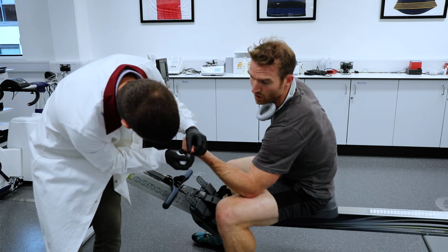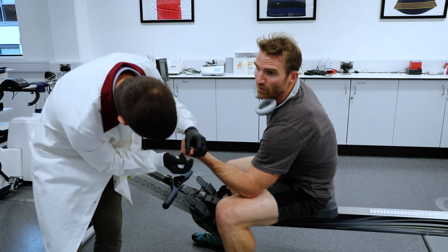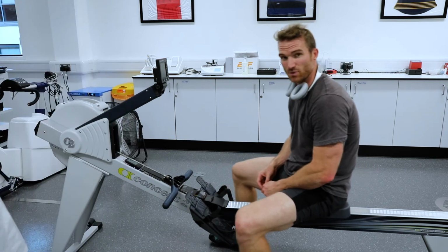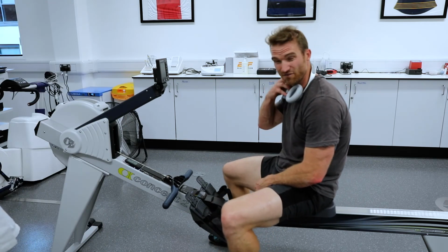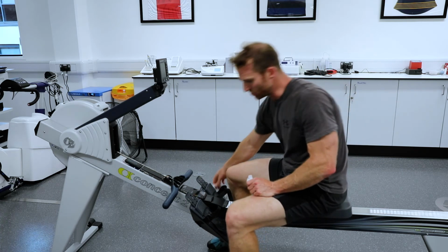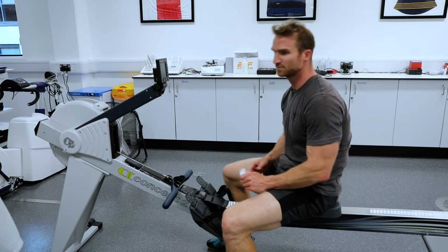So again, it's just to show when the glucose is moving rapidly during exercise, it can sometimes be worth thinking about doing a finger prick just to confirm where you are if you're concerned that it is going to be dropping along the way.